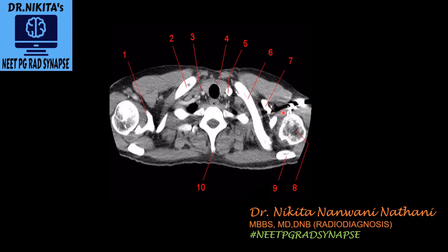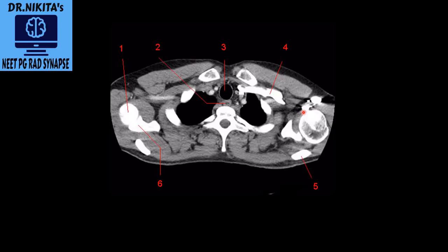Structure seven is the subclavian vein. The white artifact visible here is because contrast was injected into the patient's left upper limb, causing this artifact. Moving to the next lower slide: again we see the trachea as a black air-containing structure. Structure two, the round structure just posterior to the trachea, is the esophagus. The subclavian vein into which contrast was injected appears white. The humerus and scapula are also visible posteriorly.